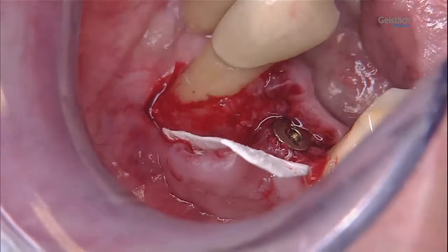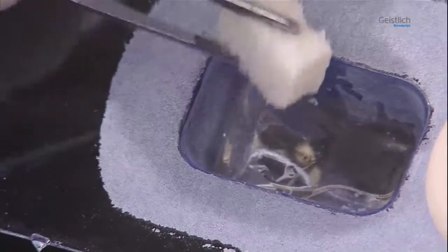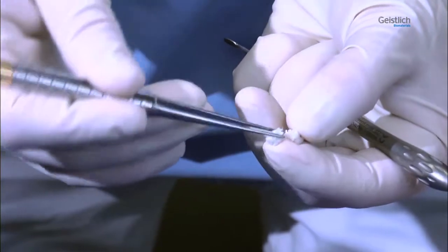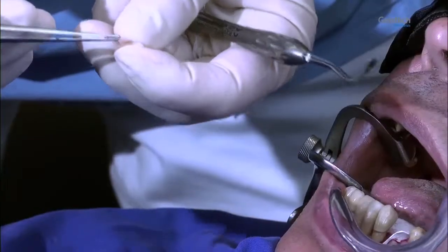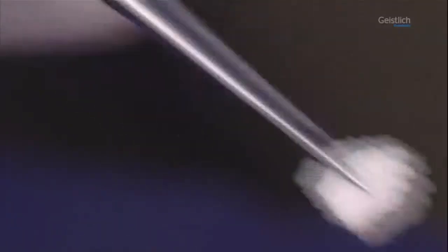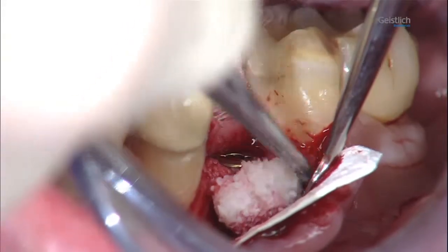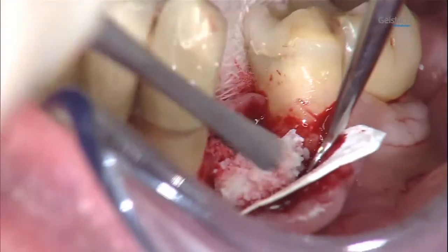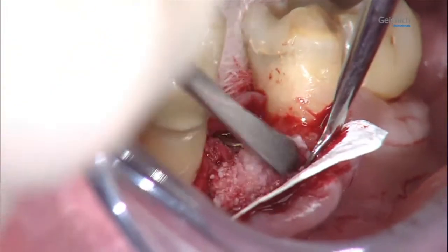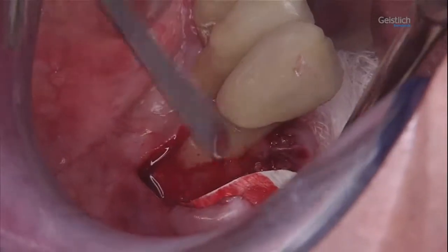The Geistlich Bio-Oss Collagen block consists of 90% Geistlich Bio-Oss granules. The remaining 10% is collagen, which holds the Geistlich Bio-Oss granules in the block together. This collagen has no barrier function. The barrier function is provided by the Geistlich Bio-Gide membrane. The block absorbs liquids very well and is easily divisible and moldable. These properties make the introduction of the bone substitute material into the defect considerably easy.